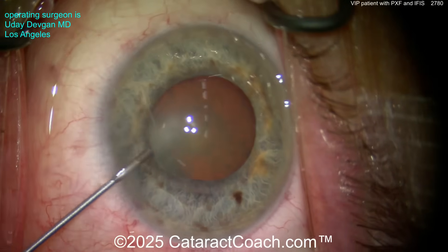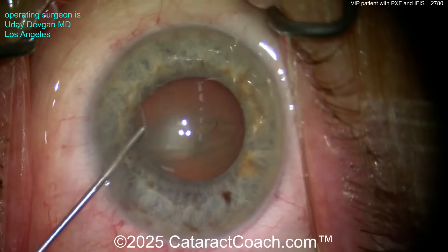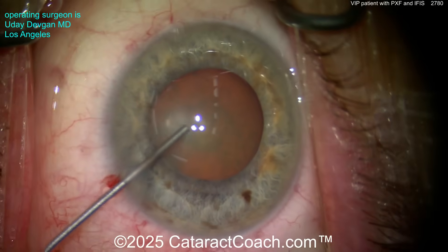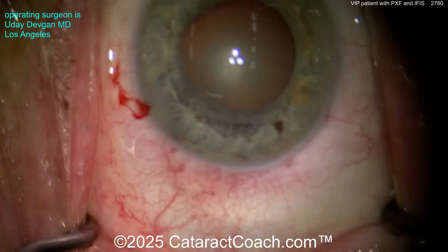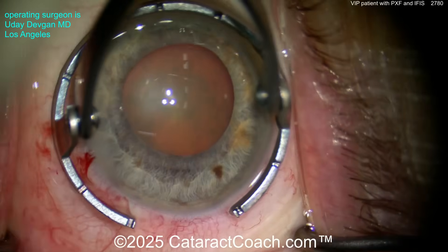You can see it's a reasonably dense cataract with a lot of posterior subcapsular content as well. As I put in the viscoelastic — here's our dispersive agent — look at that viscomydriasis. Osher taught me that; Osher's the godfather of the best. We've got a little more dilation with that viscomydriasis. Now getting the eye positioned appropriately — look at that good draping, eye in primary.